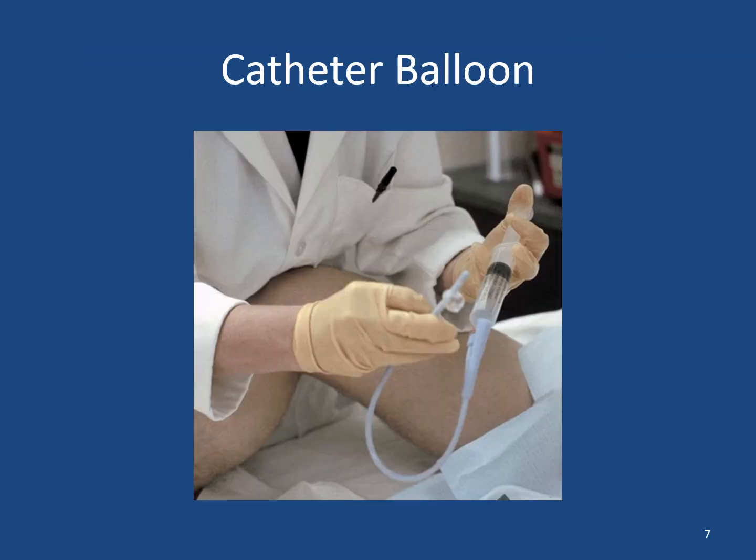The catheter balloon is filled with sterile water or sterile saline. You can see it in the image here. It is being held up. The reason it is filled with sterile solution is because if for whatever reason the balloon was to break inside the bladder, it is a sterile solution that leaks out. The idea is that it won't cause harm to the client.